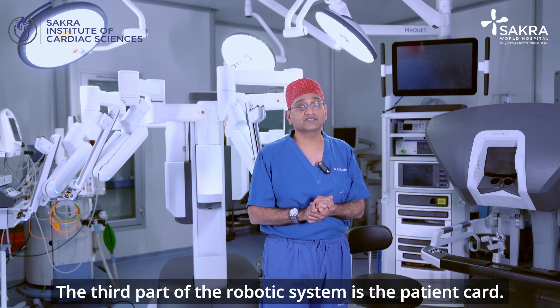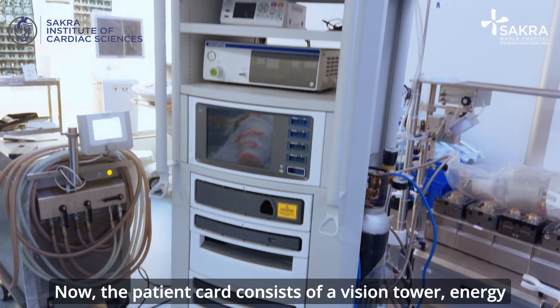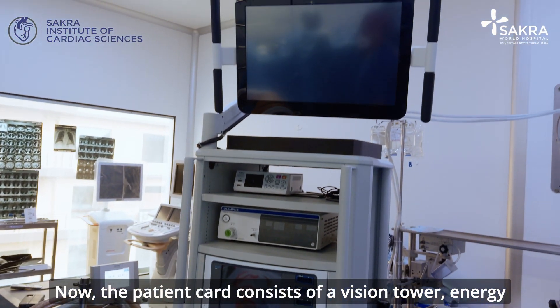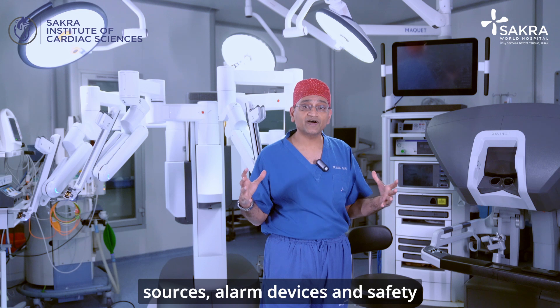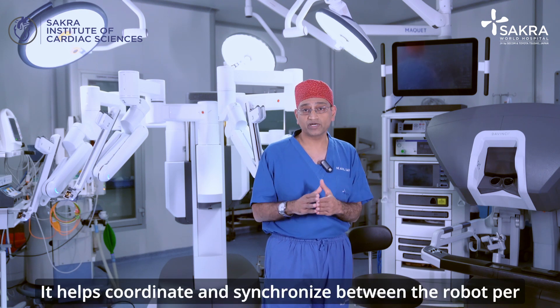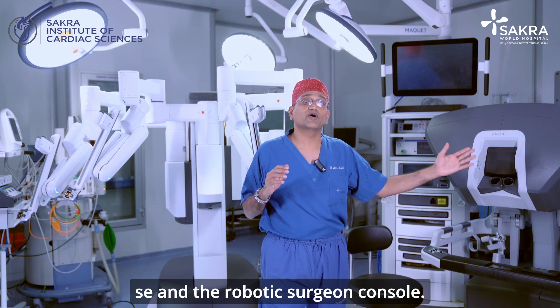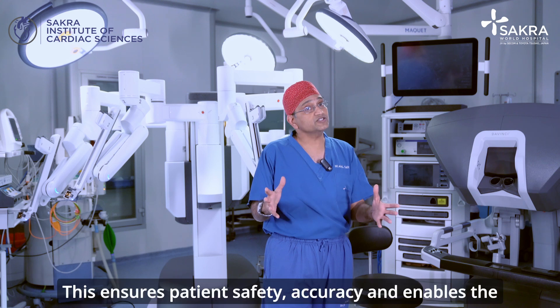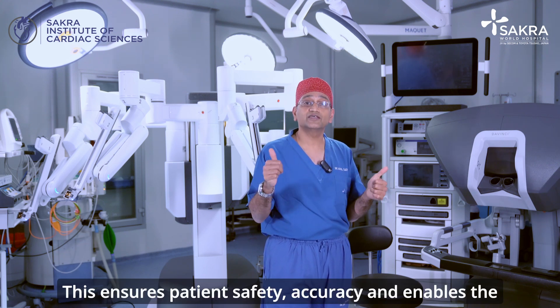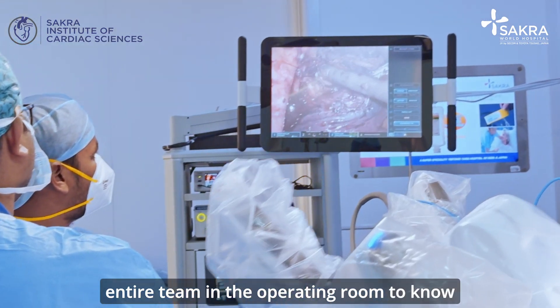The third part of the robotic system is the patient cart. The patient cart consists of a vision tower, energy sources, alarm devices, and safety mechanisms that are built in. It helps coordinate and synchronize between the robot and the robotic surgeon console. This ensures patient safety, accuracy, and enables the entire team in the operating room to know what's going on.